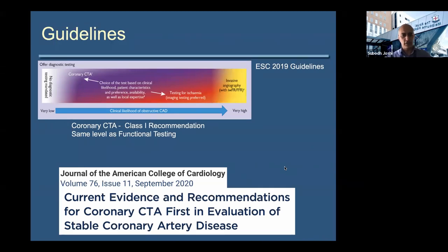But this was published just last month, which caught my eye. Current evidence and recommendations for a coronary CTA first in evaluation of stable coronary artery disease. And that's based on some of the evidence that I've mentioned today. So it looks like the guidelines might even be changing there.